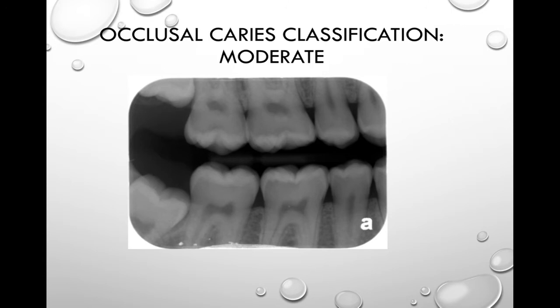Occlusal caries can be classified as incipient, moderate, or severe. Incipient occlusal caries cannot be detected with a dental radiograph. With moderate occlusal caries, the lesion extends into the dentin and appears as a thin radiolucent line between the enamel and the dentin. Looking at this radiograph, on tooth numbers two and three I can see a radiolucent band just under the enamel, and again on tooth number 30 — that is how moderate occlusal caries appears radiographically.